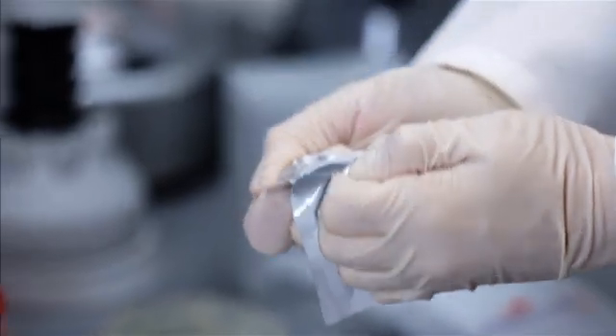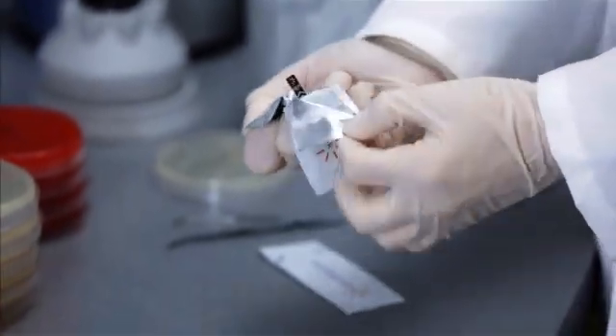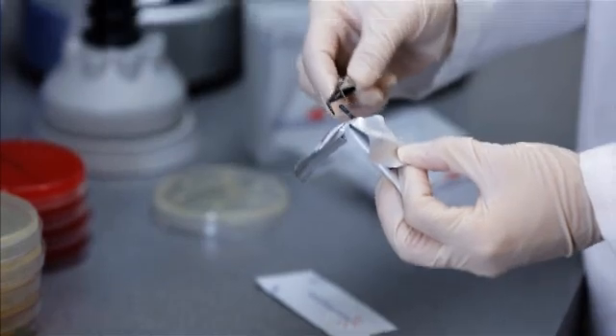Open the MIC strip sachet and remove the strip, only touching the end of the strip with the logo and antibiotic code, as this section does not contain antibiotic.